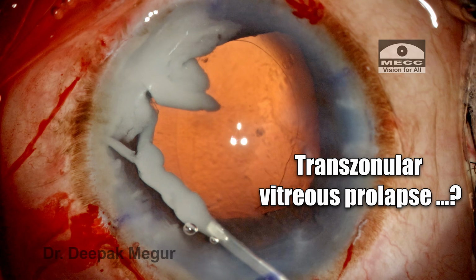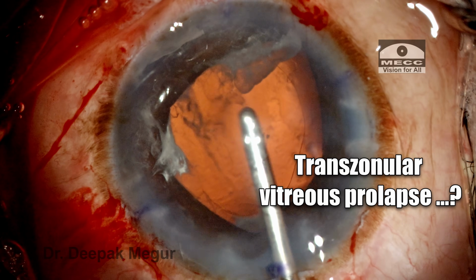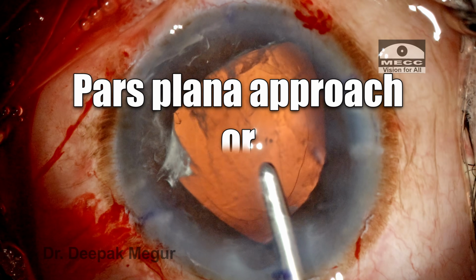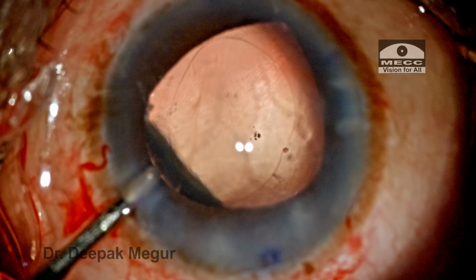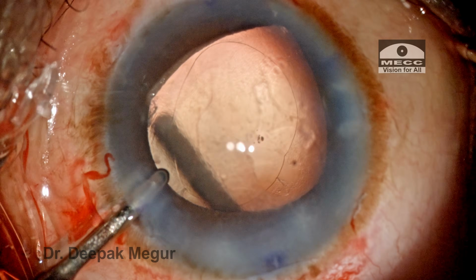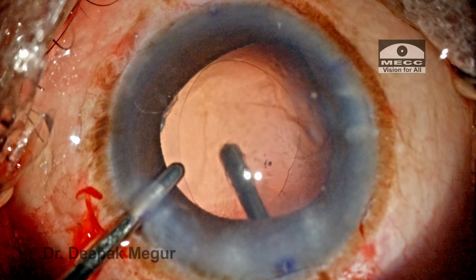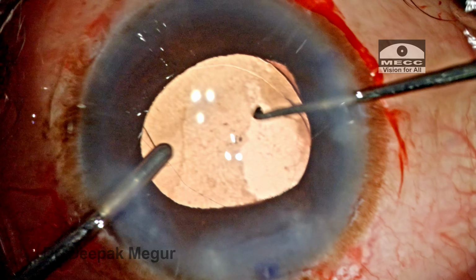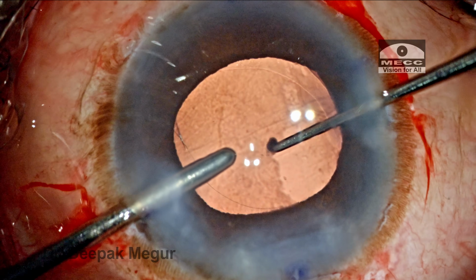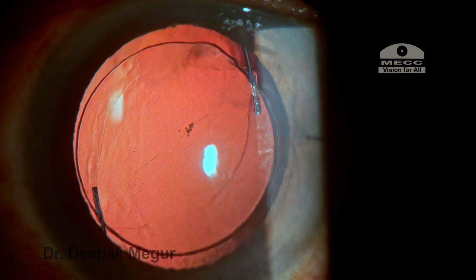And when you have a transzonular vitreous prolapse, we have to weigh in the option of translimbal versus the pars plana. If the visualization is great, the pars plana approach is probably the better way to deal with the transzonular vitreous. And lastly, fixing the IOL. The IOL trap technique would be a better way of ensuring long-term stability of the lens bag complex.